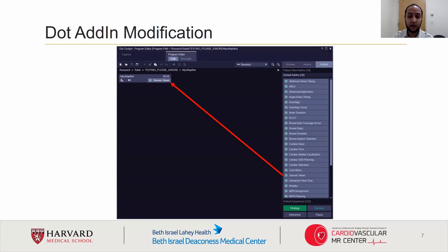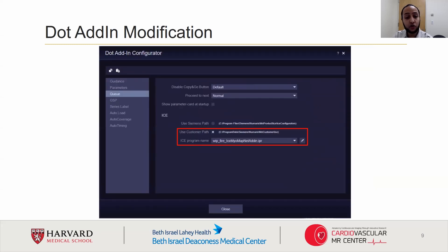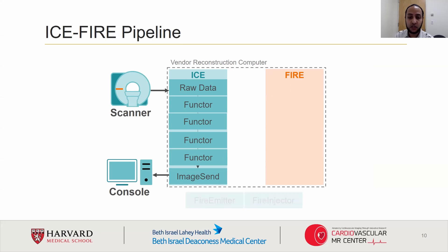In order to integrate FIRE into the ICE pipeline, we need to modify a compiled ICE program by using the Generic Views dot component, available under the default Add-ins tab. Once the dot add-in has been added to the sequence, you will see an Add-in Configuration button appear at the bottom left corner of the sequence. Then, under Queue, you will have the option of adding an IPR file, which adds two new functors to the ICE pipeline. These new functors will be the FIRE emitter and FIRE injector. The new functors can then be inserted into the ICE sequence and will be used to transmit data between the ICE server and the FIRE server.